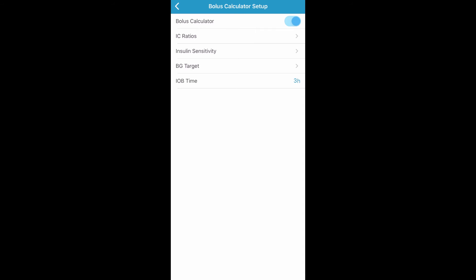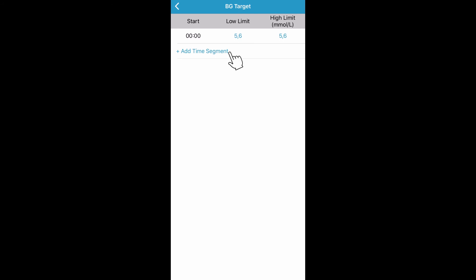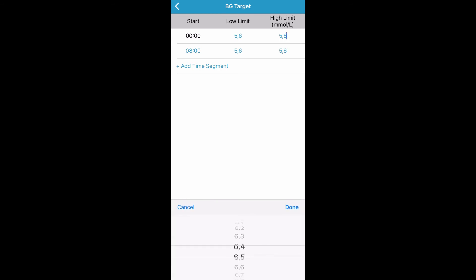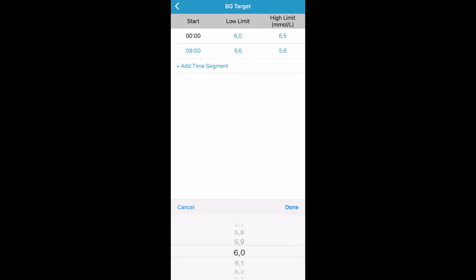Now you can set up your blood glucose targets for your pump by tapping on BG Target. You can add up to eight different time segments for the day depending on your need for different blood glucose targets at different times. Tap Add Time Segment to add a new time segment. You can adjust the blood glucose target for each time segment by tapping on the blue number next to each time segment. You will notice you can set a low target and a high target. Now tap Done. Once you have entered your blood glucose targets, tap the back arrow.